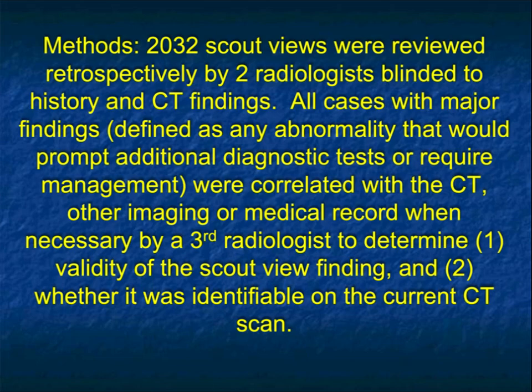And the reason it came about was he had a case, there was a case in Chicago, where a patient had fallen. It was a sad story. A child had fallen, had a fracture. Well, initially the study was read as negative. A few hours later, the child had a seizure and died. When you go back and look at the brain, you look for a hematoma, an epidural hematoma, you didn't see one. Even if you're an expert, you just don't see it. But if you looked at the topogram, a skull fracture was obvious.